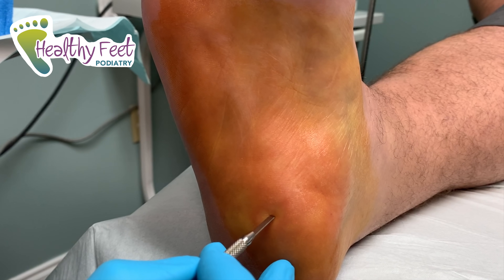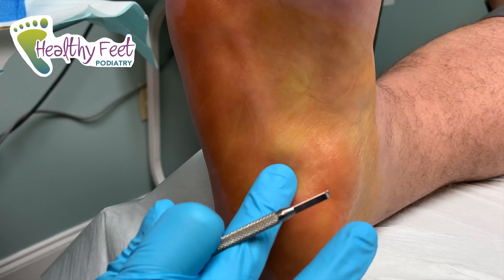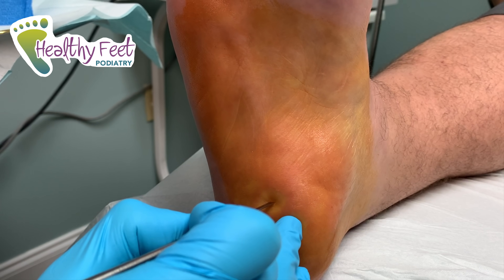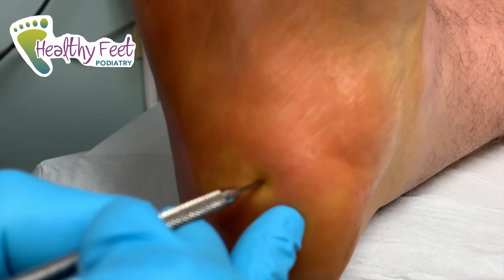Does this hurt at all, anything sharp? No. Okay, I'm going to go ahead and do a little stab right here. Any pain? No. If we're real quiet and get real close, sometimes you can hear it cutting.